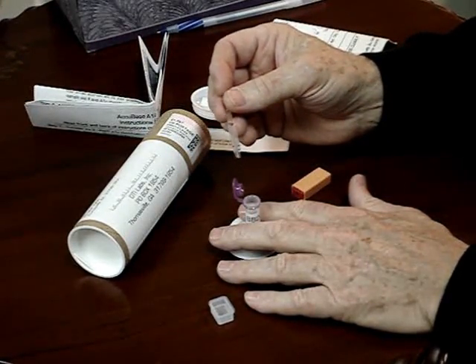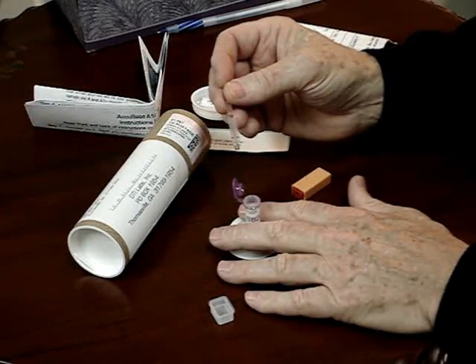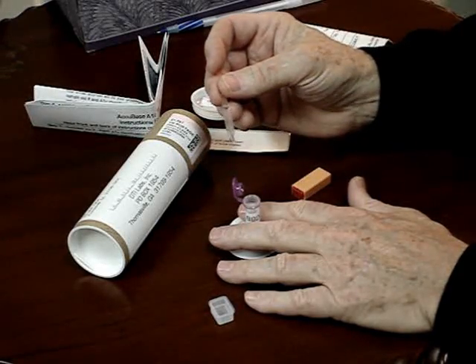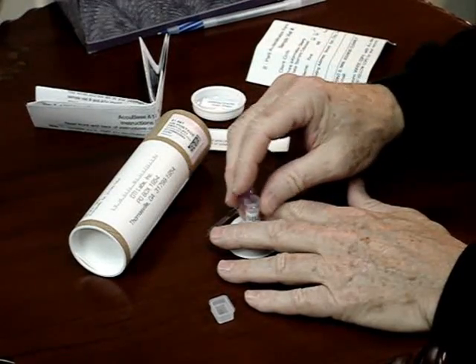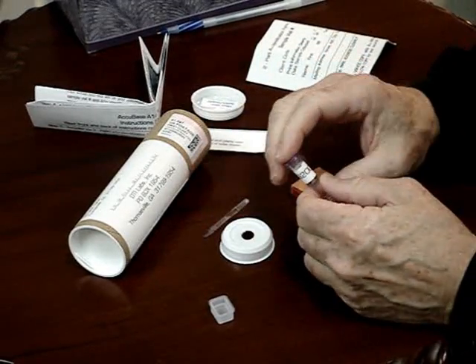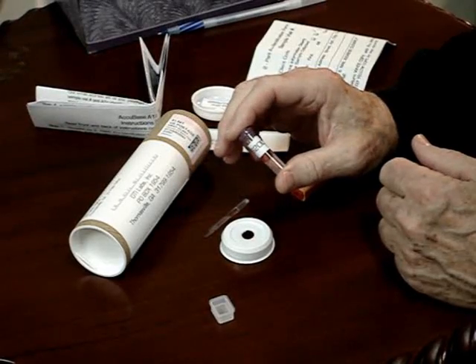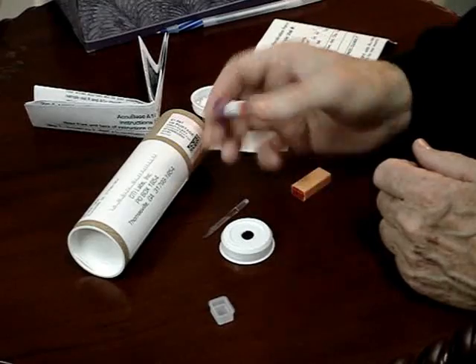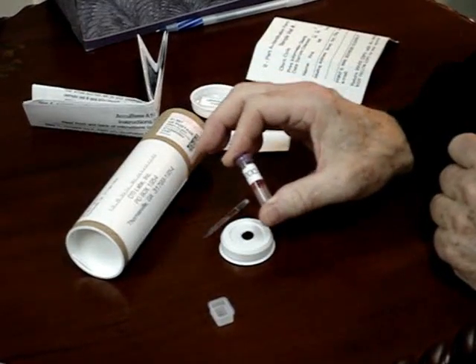You can repeat the process of squeezing the bulb again, only this time hold pressure on the bulb while you remove it from the capillary tube device and the reagents. This process will wash out the blood from the device. Next, close the vial tightly and remove from the workstation. Invert the sample a few times to mix the sample. The color of the vial should now be pink.